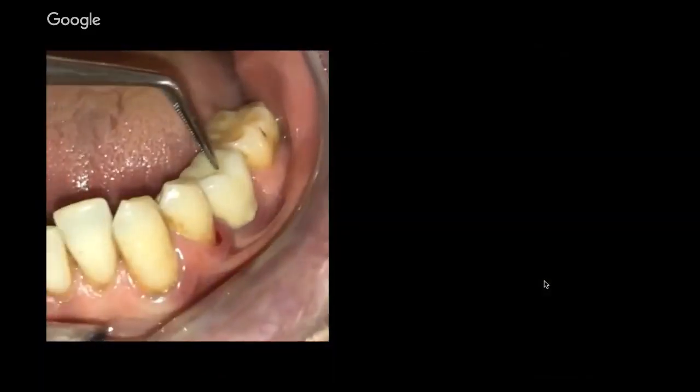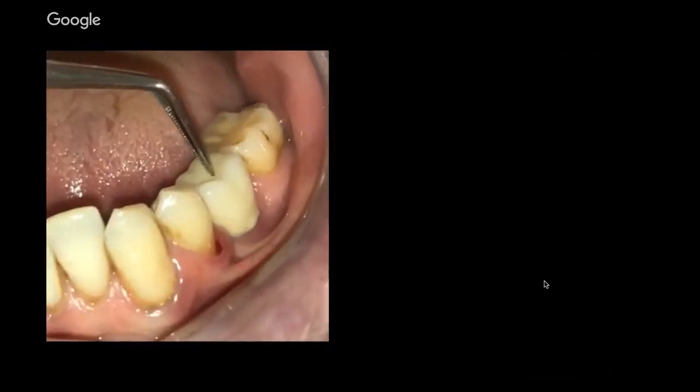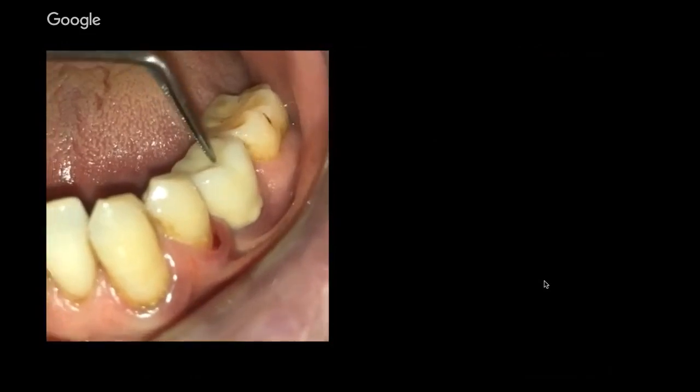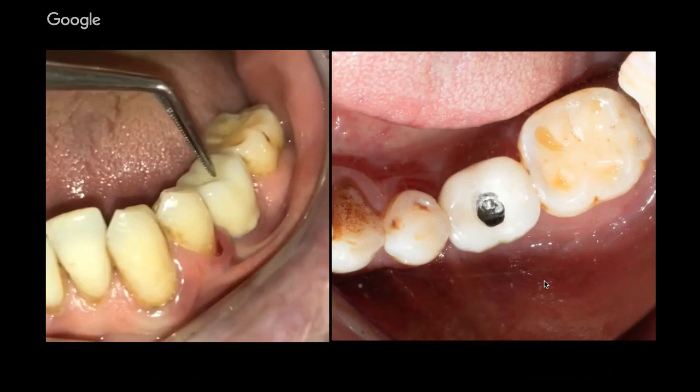Of course, this two-part system brought another problem: screw loosening. It's a mechanical complication that always bothers us when it comes to the clinic or when the patient calls us. The solution is not always as easy as it's shown here. If we are lucky, we may find the screw easily. And the solution in such a case is to open a hole on the occlusal surface of the restoration and tighten the screw. Later, composite is used to close the hole.